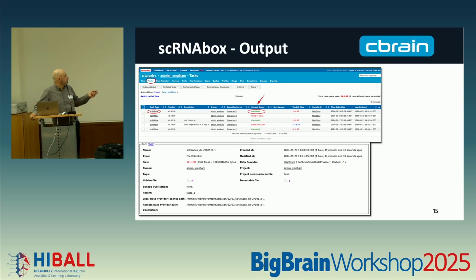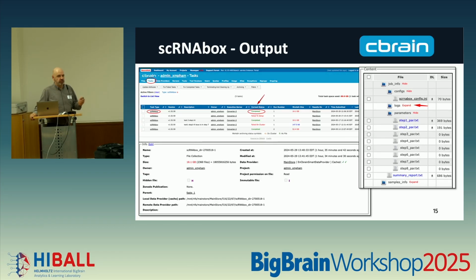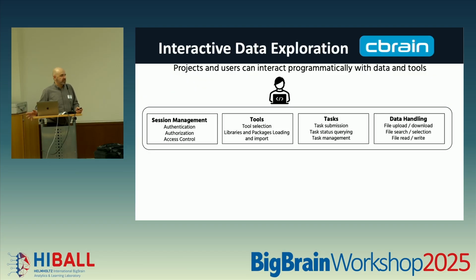It's a lot easier: when it was produced, when it was created, when it was last modified, where it was stored, what the output size is. So all these things are not ephemeral. They're purposely stored long-term, so you have that information at ease of use. And then you can visually, as I said, navigate the output, whether it's a hierarchy of files. Again, it depends on the nature of the tool. It's visible there. You can extract certain individual files if you want. You can, depending on the nature of the file produced, directly view it within the browser. So that's, I would say, the web view side.